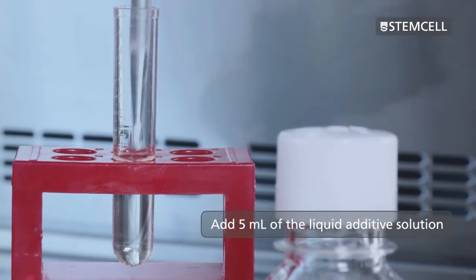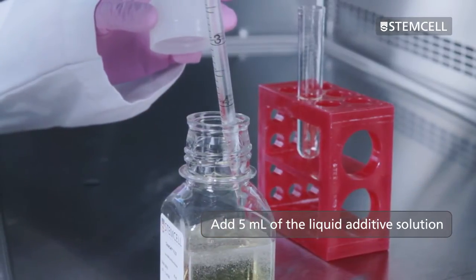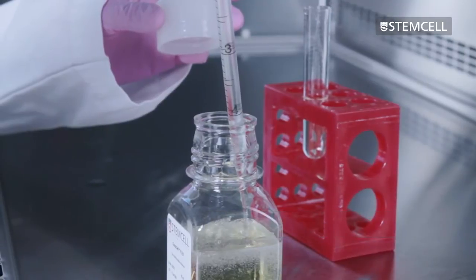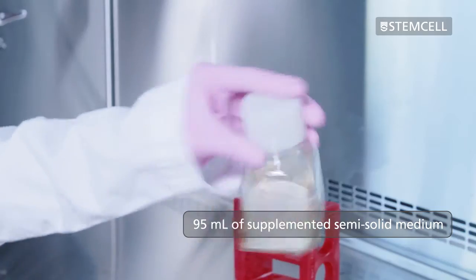Add 5 millilitres of the liquid additive solution to the bottle of Clonacell semi-solid medium. Your bottle should now contain 95 millilitres of supplemented semi-solid medium.